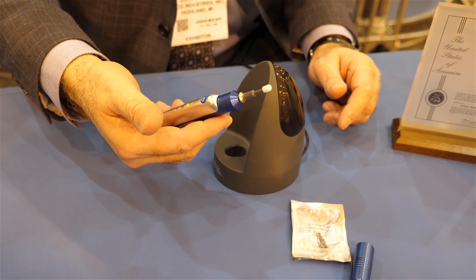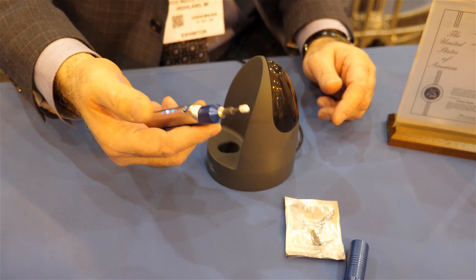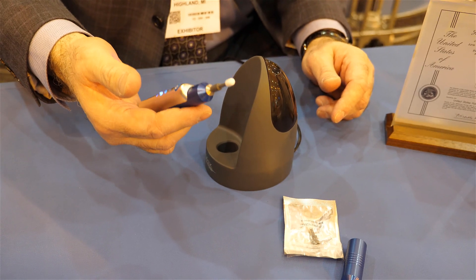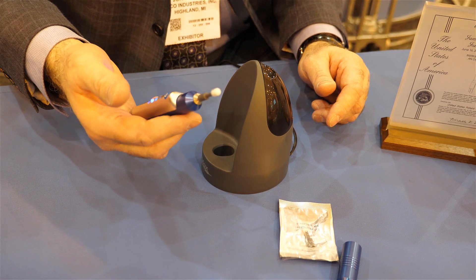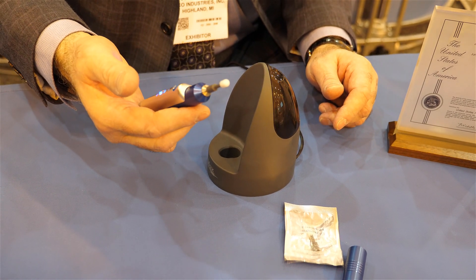They press the button again and it goes into reverse mode. Then they press the button again and it goes into pulse mode, which we have a patent pending on. Pulse mode is much more comfortable for the patient, does a much better job of debriding, and also massages the anterior eyelid margins.